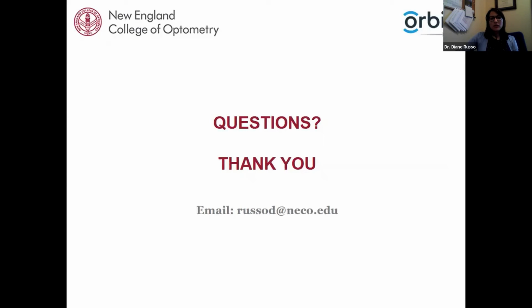When doing near vision testing, do you use one eye at a time or both eyes at the same time? So typically I conduct near vision testing, which I know we didn't get into today, with both eyes, binocularly. Again, this goes to if you've done everything that you were supposed to do at distance, right? You corrected each eye to its best corrected visual acuity, you balance the vision between the two eyes, that all should apply at near as well.